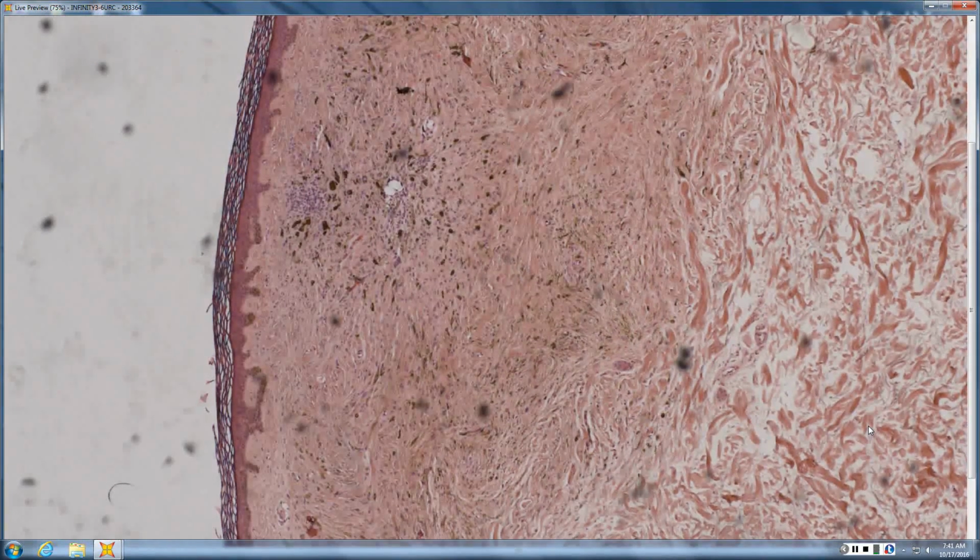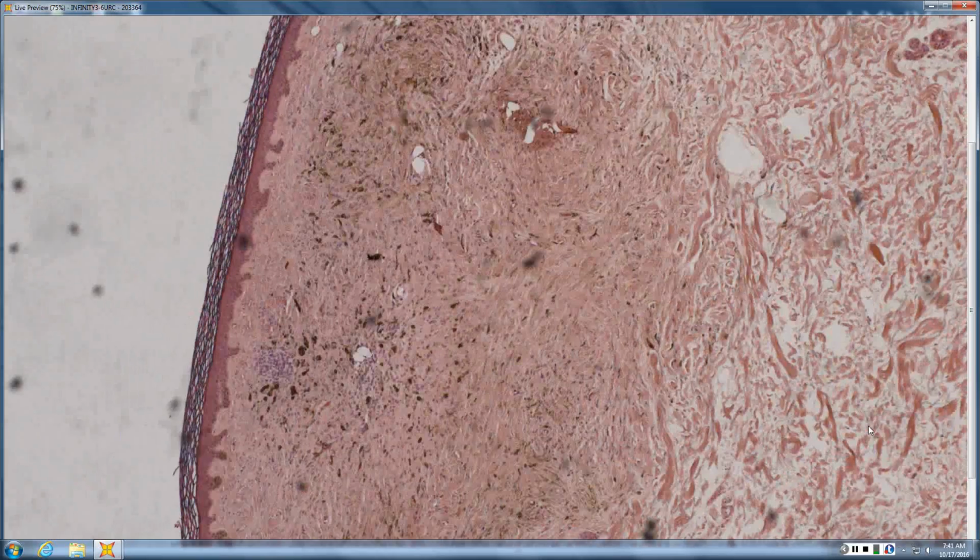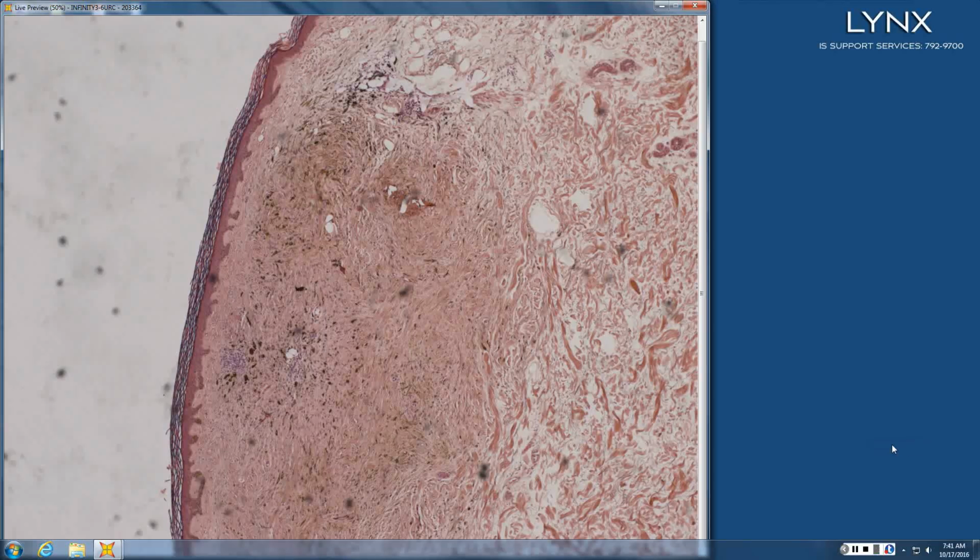So, punch biopsy of a melanotic lesion looks like a blue nevus. Why does it look like a blue nevus? Very good gestalt. It's like my sister, so I recognize her. It's the spindliness of it, the pigment that you're getting, the wedge shape. So wedge-shaped, dendritic melanocytes, and it has its own sclerotic stroma that's different from the regular dermis.